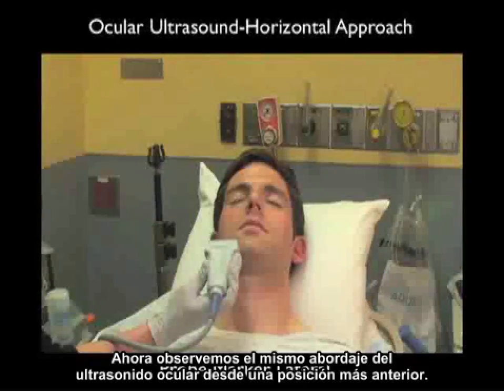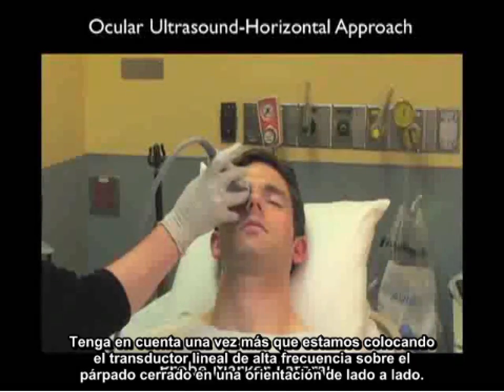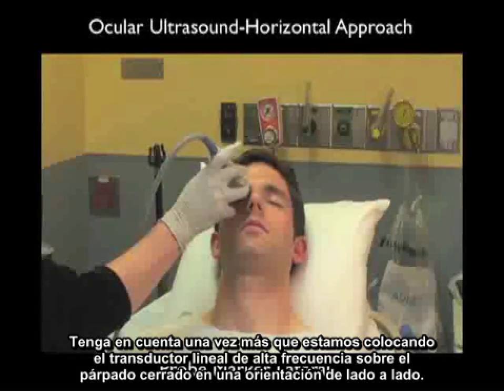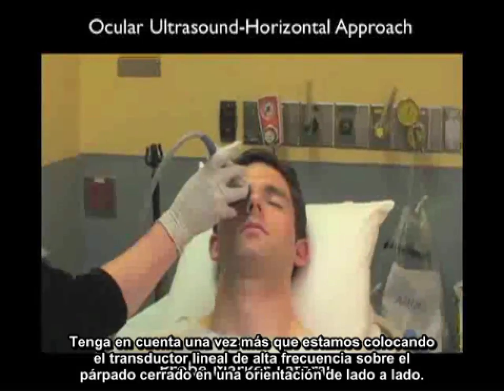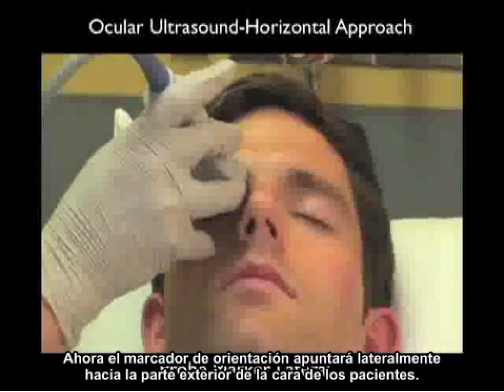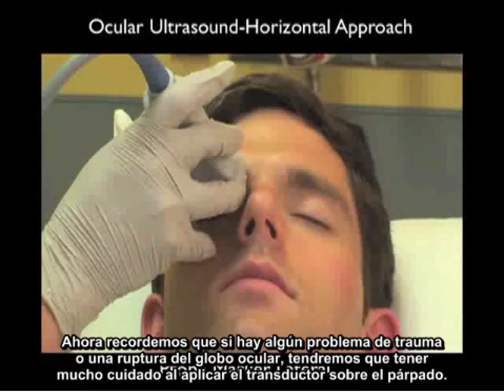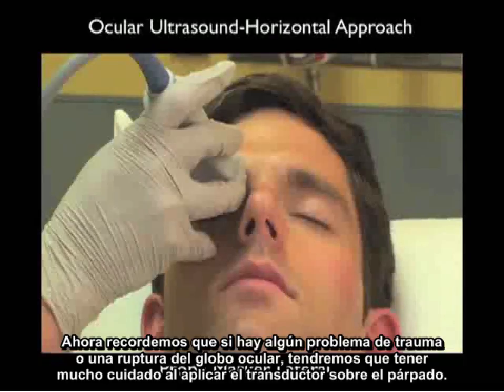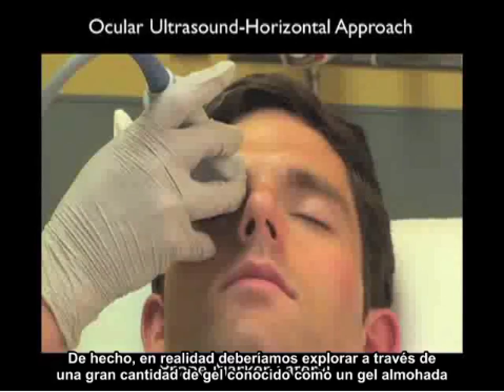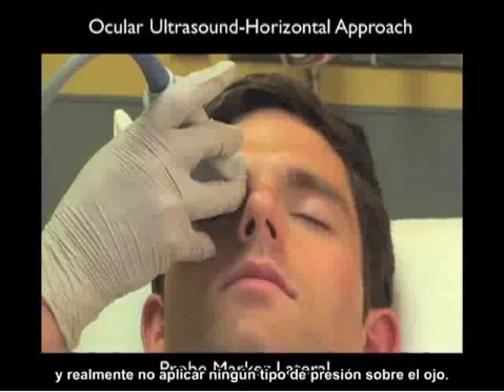Now let's take a look at that same ocular ultrasound approach from a more anterior position. Note again that we're placing the probe, the high-frequency linear type array probe, over the closed eyelid in a side-to-side orientation. Now the probe marker is going to be oriented laterally towards the outer part of the patient's face. Remember that if there's any question of trauma or globe rupture, we have to be extremely careful when applying the probe onto the eyelid. In fact, we should really be scanning through a copious amount of gel, known as a gel pillow, and not applying any pressure down to the actual eye.